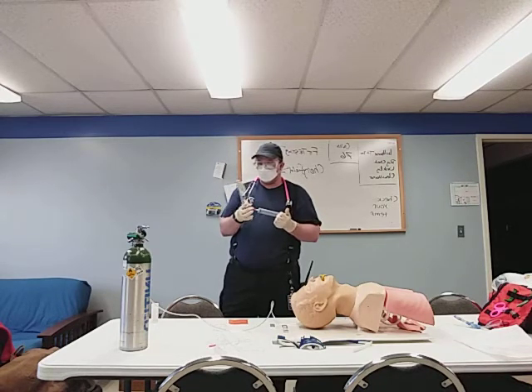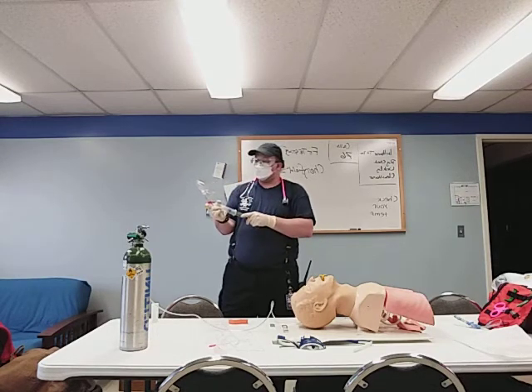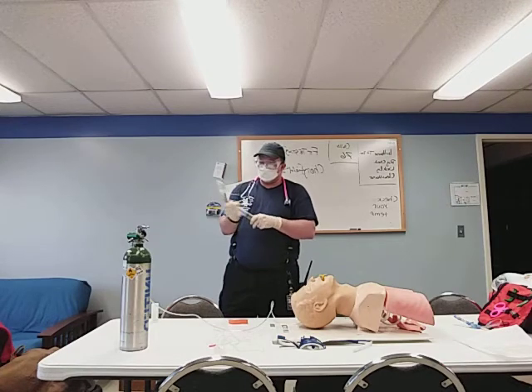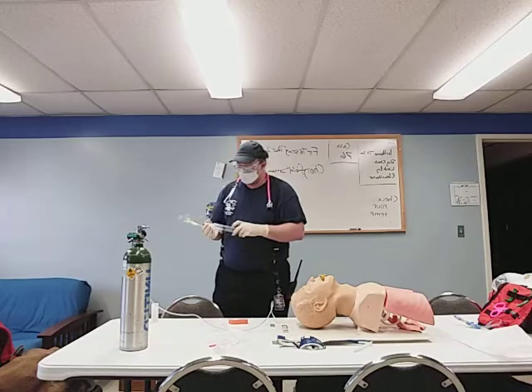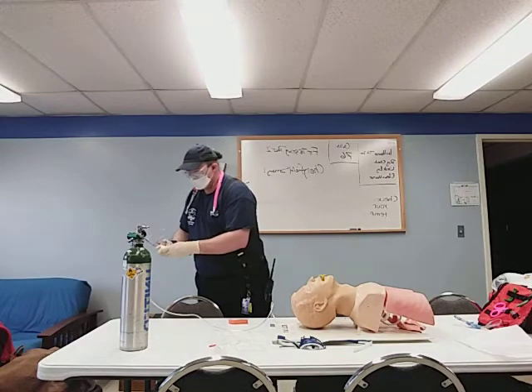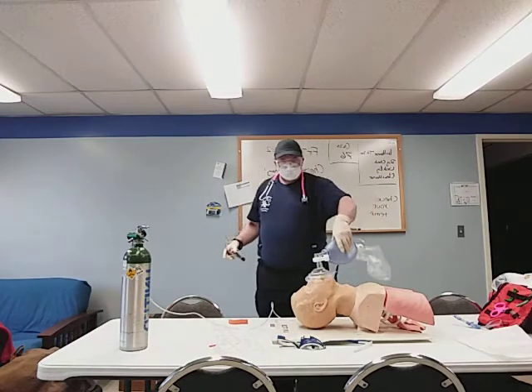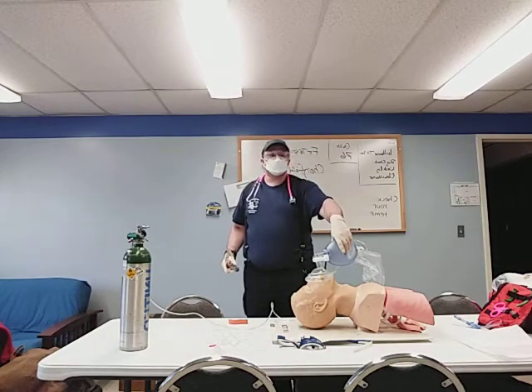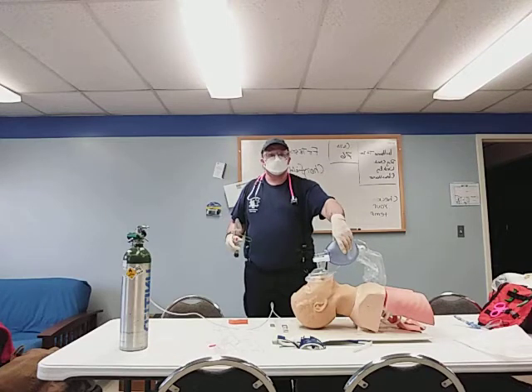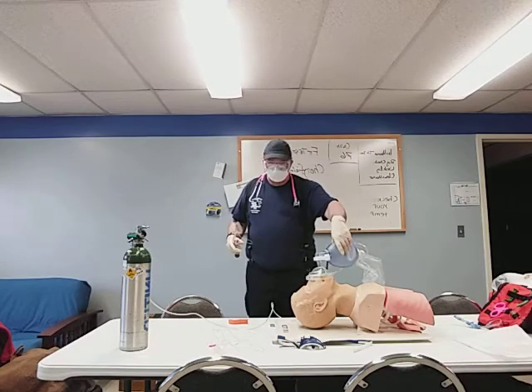My pilot bulb, everything is intact, no cracks, no holes, no leaks. We are in good shape, I think. All right, now maybe just a tad more. So the examiner is ventilating, and I'm going to instruct the examiner after the next breath to remove the bag valve mask and the OPA and allow me to take over. Insertion of the advanced airway. All right, so here we go.